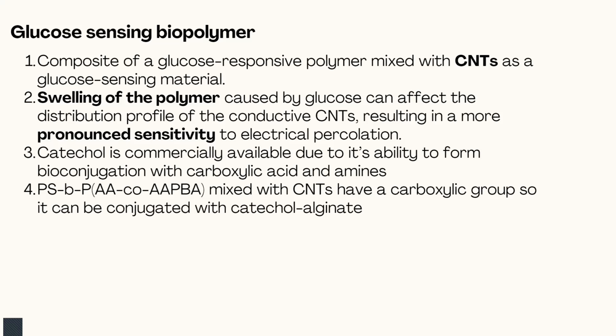So this can be used with an adhesive layer, because catechol is commercially available due to its ability to form bioconjugation with carboxylic acid and amines, and the polymer which we discussed has a carboxylic acid group, so it can be conjugated with catechol alginate to form the biosensor which we are discussing.